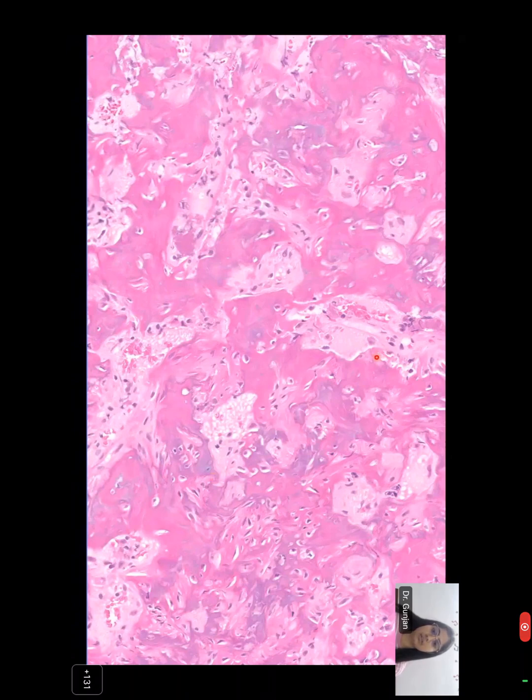Right. Osteoblasts, again for the audience, should look like plasmacytoid cells, and they're very hard to see. Instead, what you have is some sort of loose vascularized stroma and sheets of bone production with very, very benign-looking osteocytes. I didn't mean to do this, but it's a nice contrast with the osteosarcoma, right? At least on this biopsy, we don't really see any infiltration of pre-existing bone.